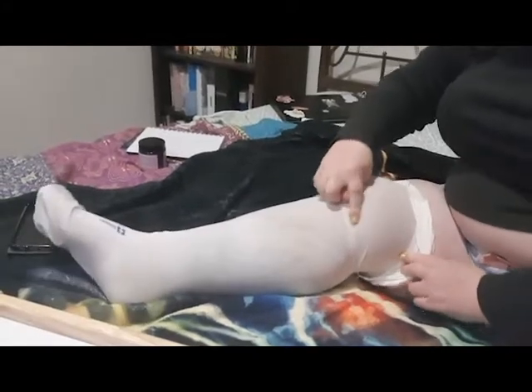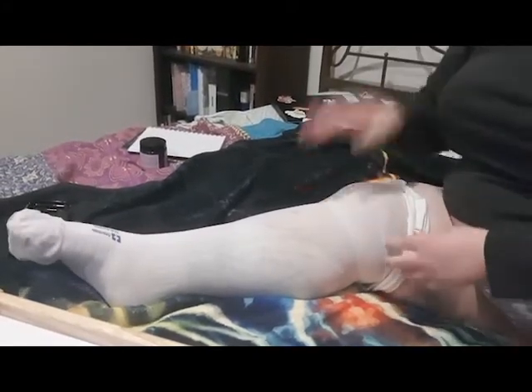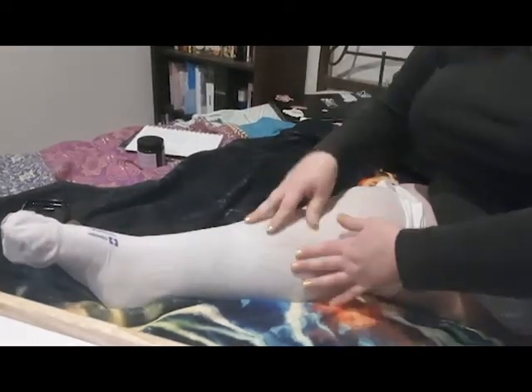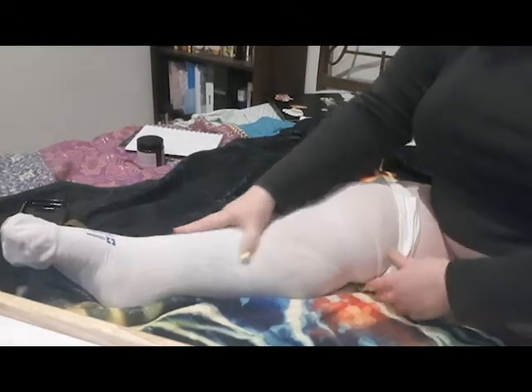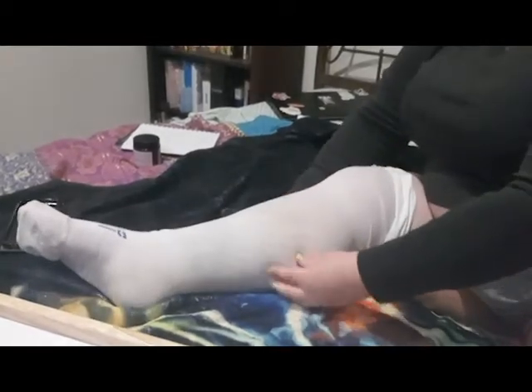You can see again, more wrinkles. That will be fine at first. And then after about half an hour, you'll find that it'll start to get sore. I have very little feeling in my legs, but even so, I'll be like, there's just something wrong with my leg, and it's because the pressure is a bit weird.